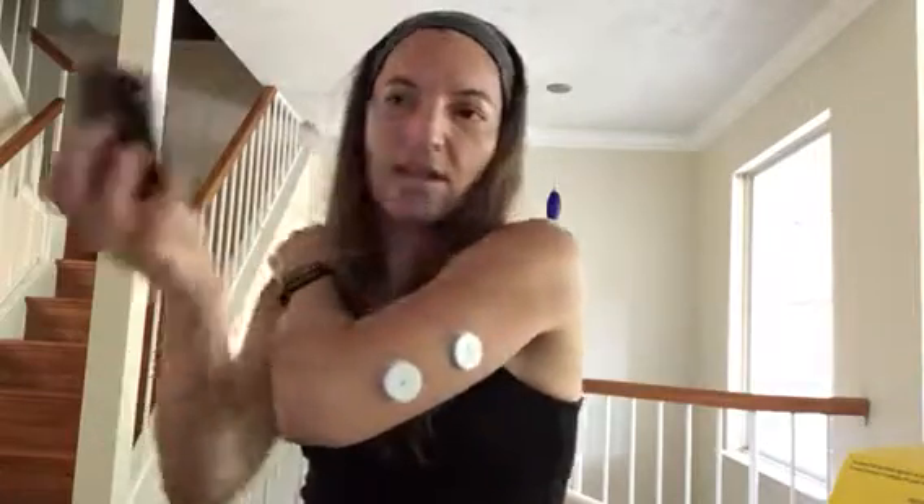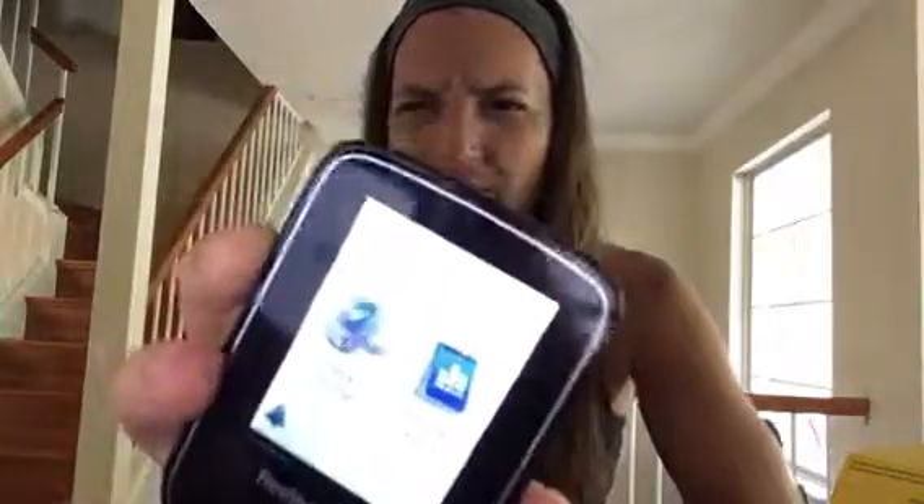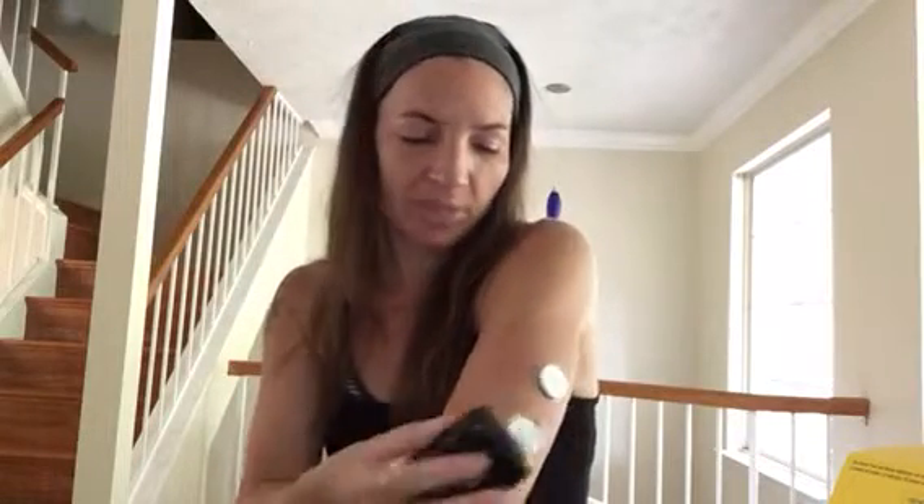I'll wait just a minute. Here's my old sensor and here's my new one. If I scan my old one - you can't see it but my sensor is ending in five hours. I hit okay, go back out to the main screen, hit 'check glucose,' and I'm going to scan the new one.